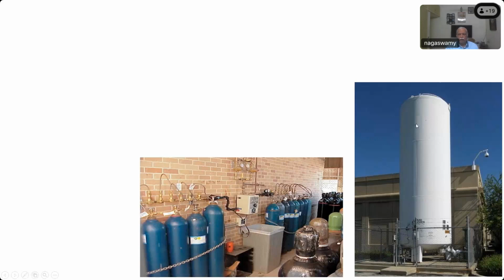And this whole thing is called a VIE. What is the expansion of VIE? Vacuum insulated evaporator. So even though it is called a liquid oxygen tank, the correct name for it is VIE, vacuum insulated evaporator.